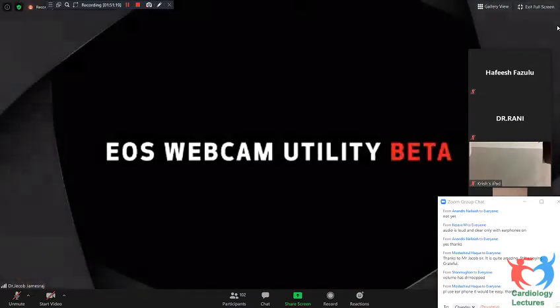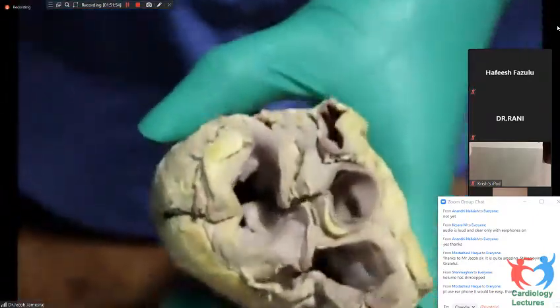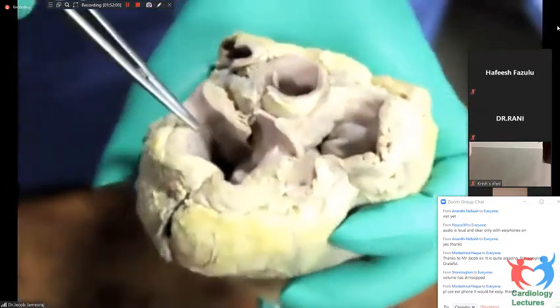Coming to the conduction system of the heart, we look at the sinoatrial node, the SA node. It's a specialized pacemaker myocyte collection located in the right atrium. It is a subepicardial structure near the superior vena cava. It consists of nodal cells, transitional cells, and atrial muscle cells. It's supplied by the sinus nodal artery. So you can see the artery here, and this is surrounded by the SA nodal cells. Nodal cells are very difficult to appreciate. They are surrounded by fibroblasts.